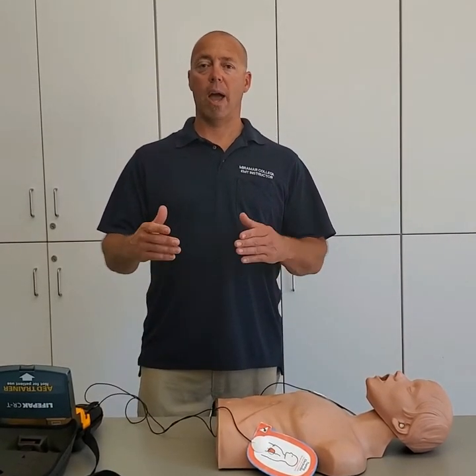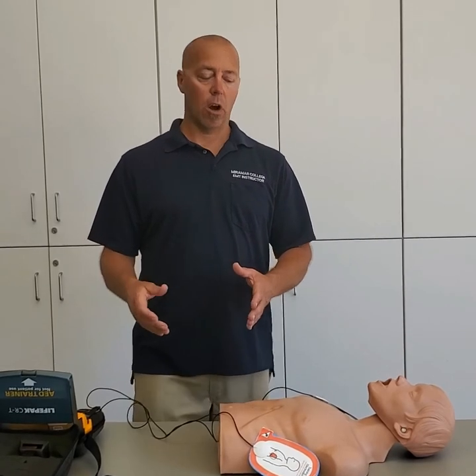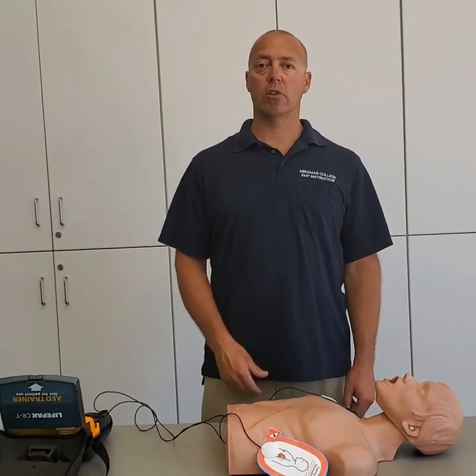Directly after hitting the shock button and delivering the shock, your next action is to get right back on the chest and continue CPR.